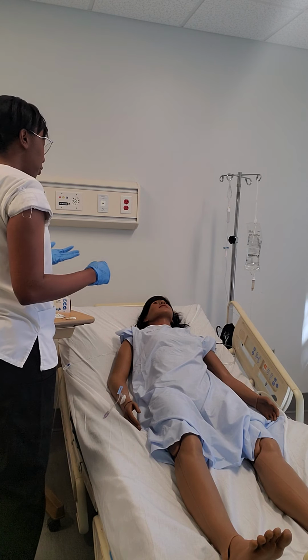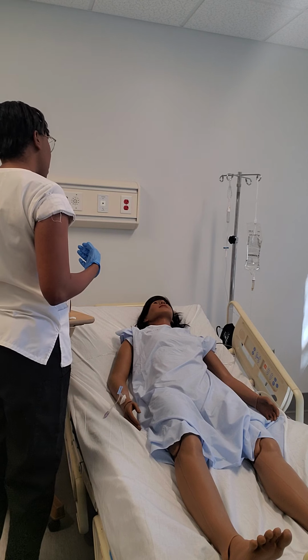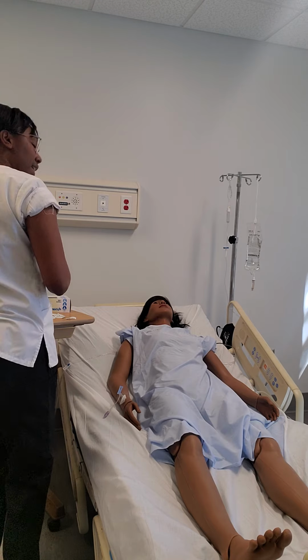And also, I reiterate to the patient not to get up too quickly because there's that risk for the orthostatic hypotension. We wouldn't want you to experience any of that. And that is it.